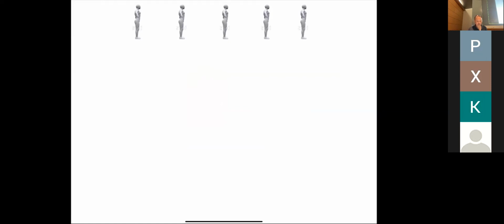So here's the exercise that we used to do in person. Imagine each of these represents a spin, and let's say the spin direction is going this way, okay? So in a laboratory frame, they'd all be spinning around at the same rate, right, in a uniform field, okay? In the rotating frame, they stay constant, right? They're not going to rotate around because they're in the rotating frame. And this guy is at isocenter, okay?